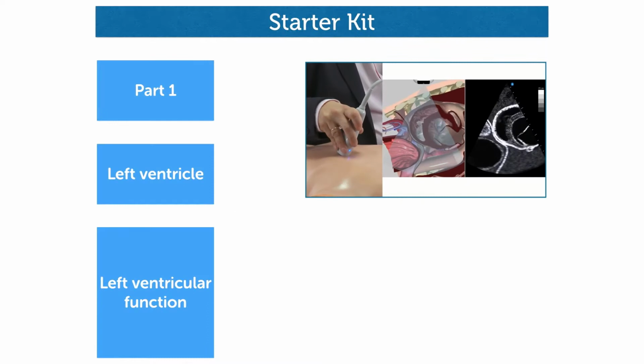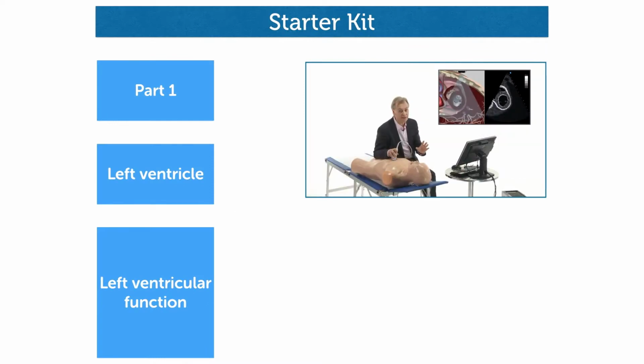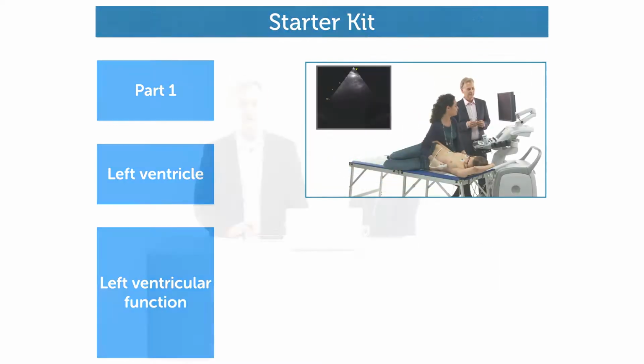Welcome back to the second part of our Echo Starter course. In the first part, as you probably remember, we talked about the left ventricle and how to assess left ventricle function. And this actually sets you aside from many of your colleagues now, because now you will be able to quantify left ventricular function, an extremely important feature in every cardiac disease. But before we start, I want to review what we learned about the left ventricle function.